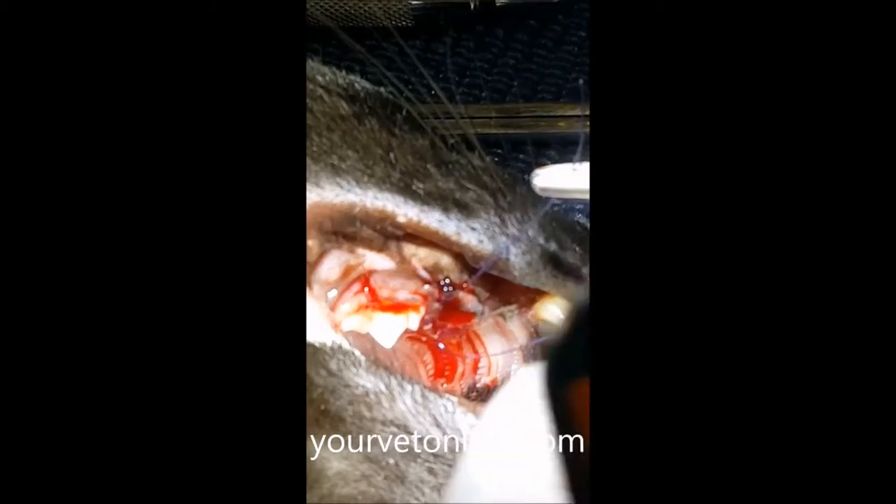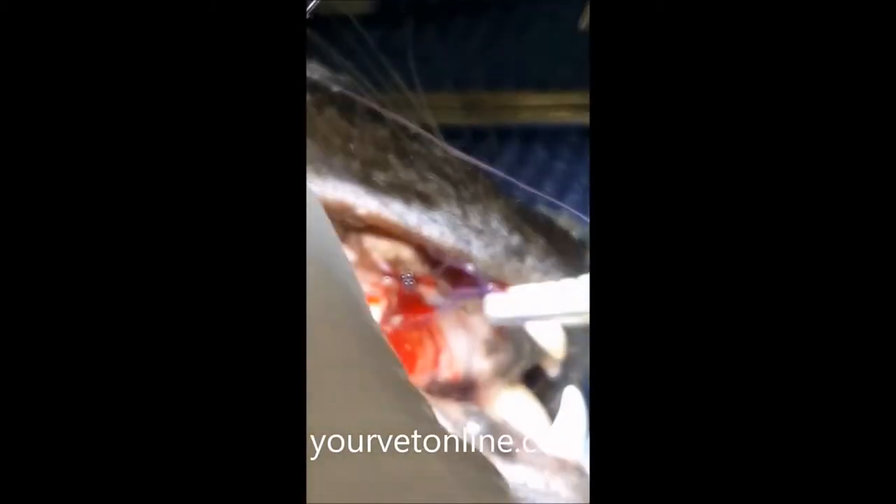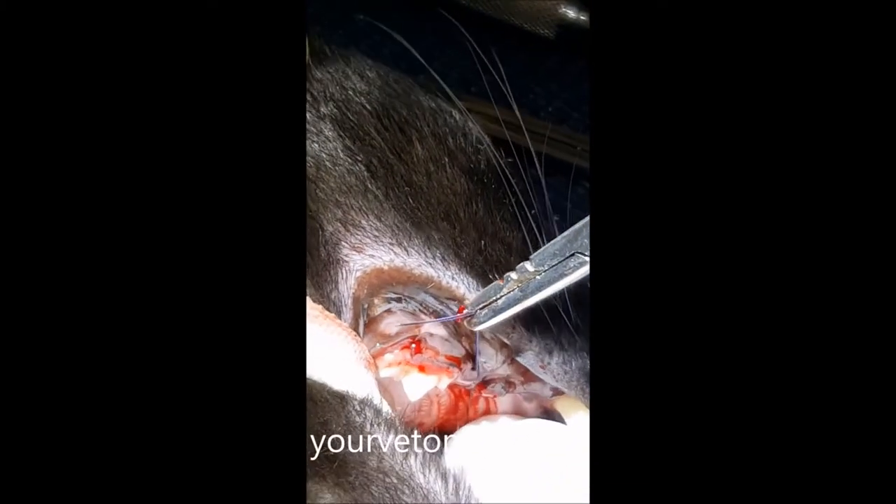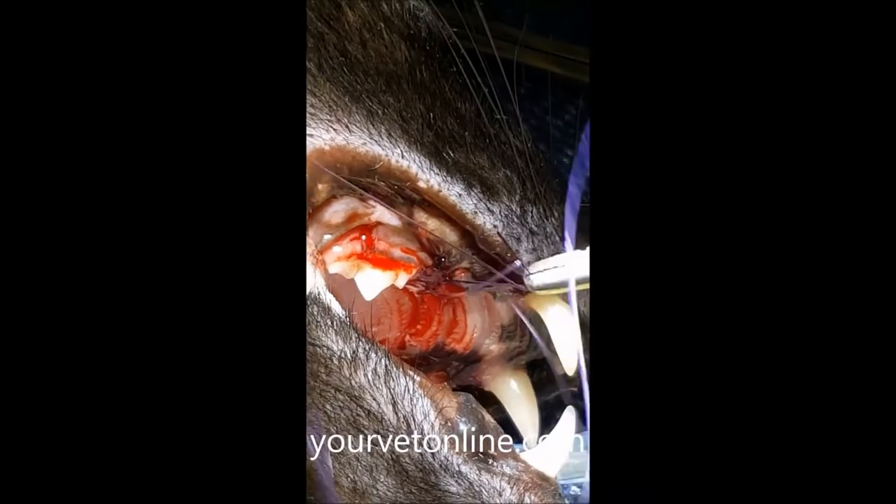It's an absorbable suture, and what that means is that once the tissue's healed, this suture will actually dissolve over time. So there's no need for us to come back in afterwards to remove these sutures — they will dissolve in their own time.